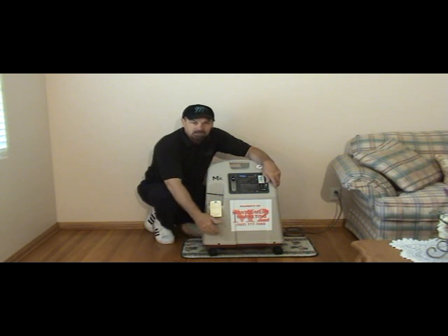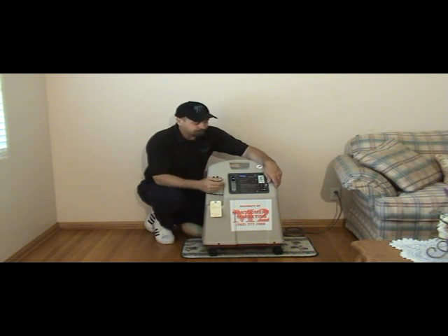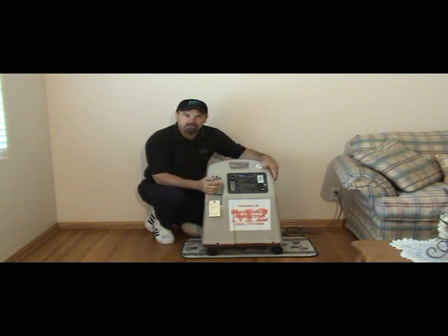Don't put anything underneath it. Again, this is mobile. You can roll it around, so if you do need to put it in another position, you can do that. Do not hook it up to an extension cord.